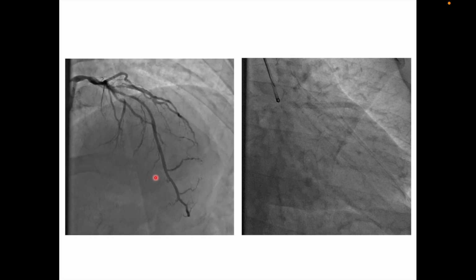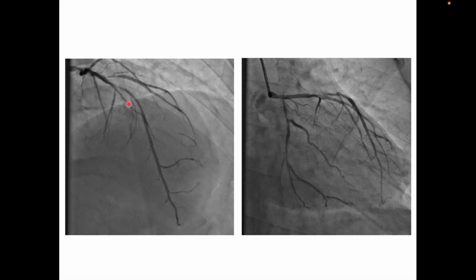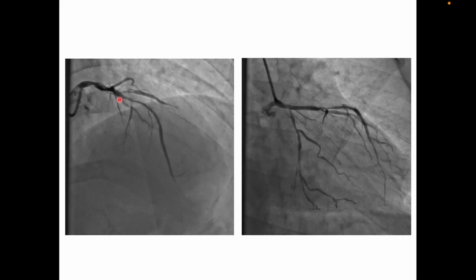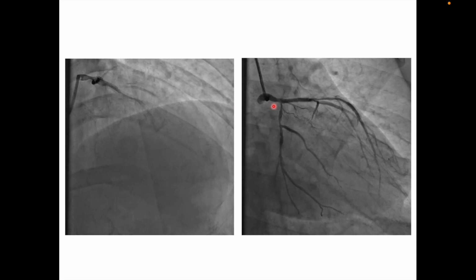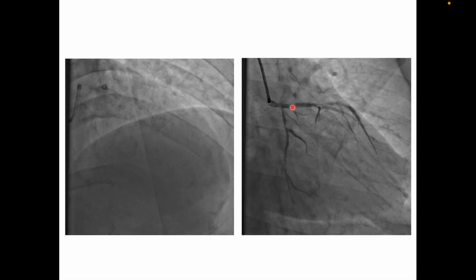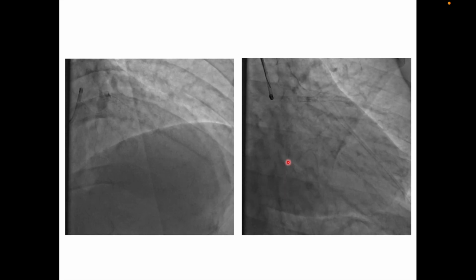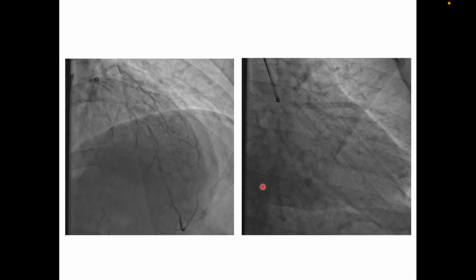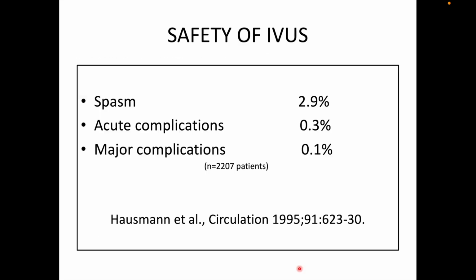So now you can see that this patient has significant disease in the mid LAD stent, distal left main stem. That's quite a significant diagonal which has a very critical ostial disease. There is a significant critical ostial circumflex disease followed by significant disease in the proximal segment, and then critical ISR in the OM. So this patient was then advised CABG.